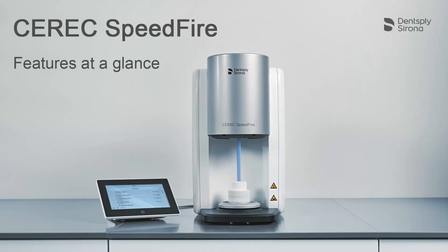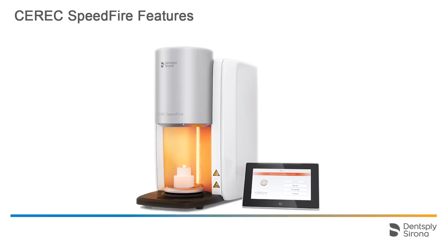Welcome to this video tutorial on the CEREC Speedfire. This video demonstrates the features of CEREC Speedfire and provides an overview of the validated block materials that can be processed. To begin with, we will take a look at the most important features.